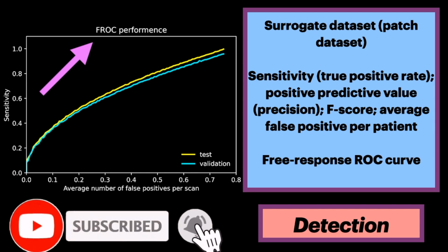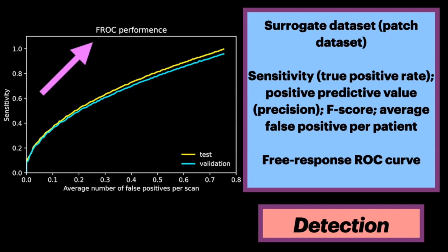A CNN is then trained on this patch dataset as if it were a classification task. It can subsequently be applied in a sliding window fashion across an input image, or on a subset of pre-selected image patches previously obtained with a sensitive candidate selection method. By casting the detection task as a classification one, pre-trained architectures can again be leveraged to achieve good performances with small datasets.